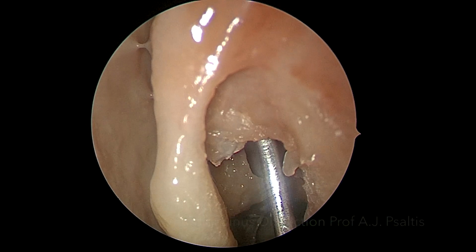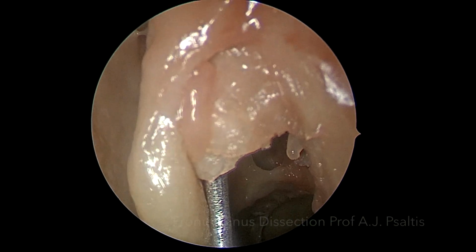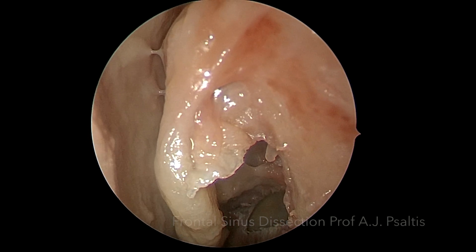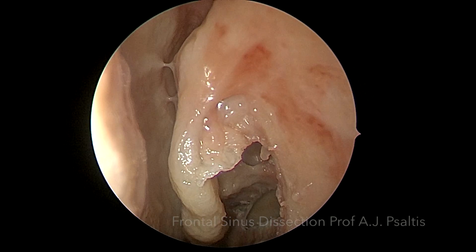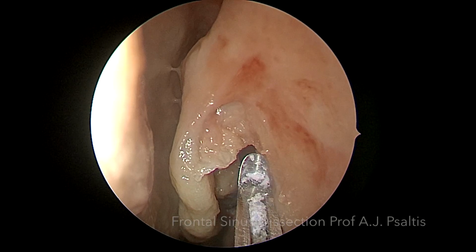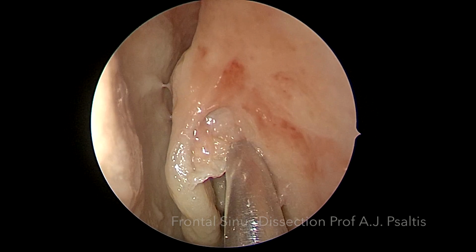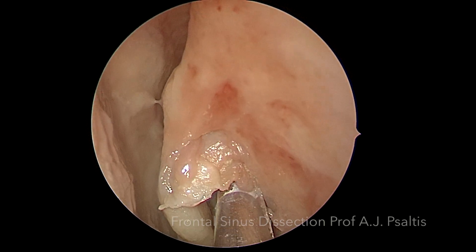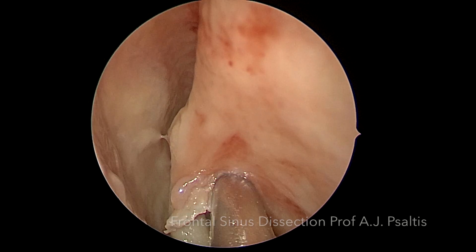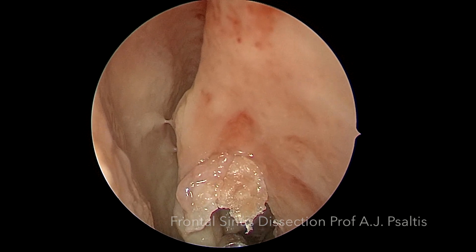The frontal recess dissection is found by locating the top of the uncinate process and fracturing it forward. This forms the anterior face of the agger nasi cell and is a useful, consistent landmark in sinus surgery. Once it has been fractured outwards, a Kerrison can be used to remove the front face of the agger nasi cell.